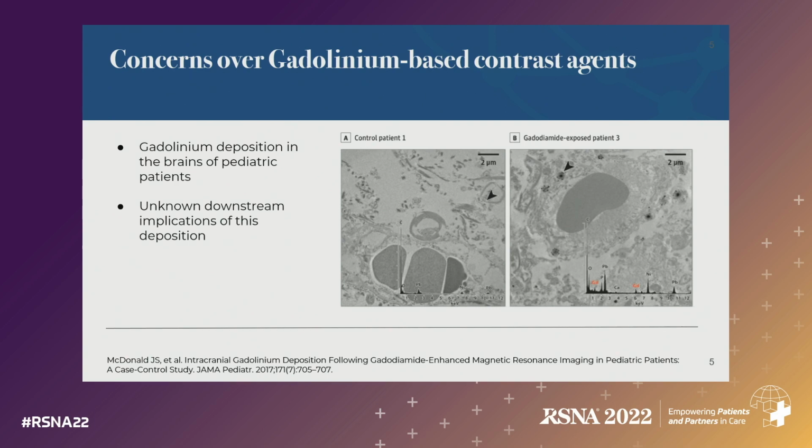Another dose I'll discuss is gadolinium-based contrast agents, used for contrast-enhanced MRI exams. By some estimates, gadolinium is administered in up to 40% of MR procedures. There's a growing body of literature demonstrating that GBCAs lead to long-term deposition of gadolinium in the brain, especially in pediatric patients. We do not fully understand the implications of this at this time. Therefore, it is prudent to again follow the principle of reducing dose to be as low as reasonably achievable.